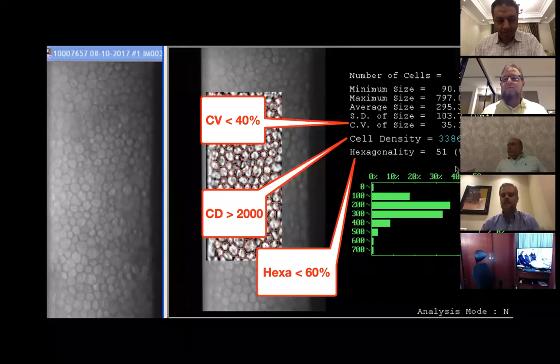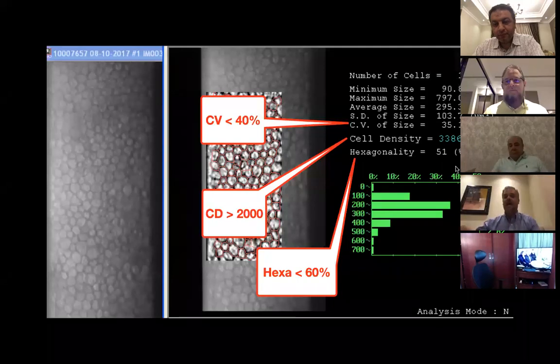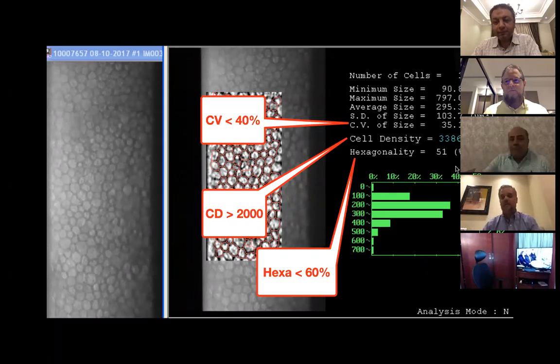I noticed that there are some doctors who, when they have an upside down ICL and they try to return it in the eye, sometimes lose a lot of endothelial cells during the surgery. Then the patient will have corneal edema. I think that after this kind of surgery, the patient will lose a lot of endothelial cells, and they can have decompensation very fast. When you have an upside down ICL, I had it once.